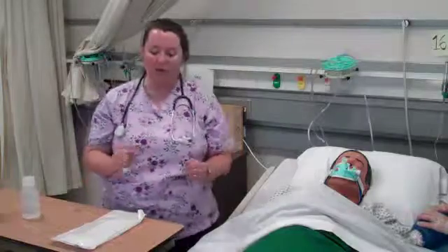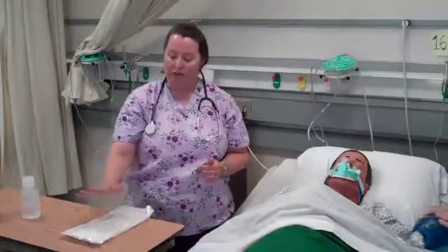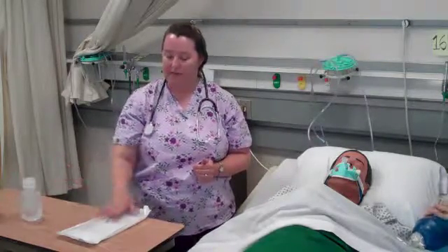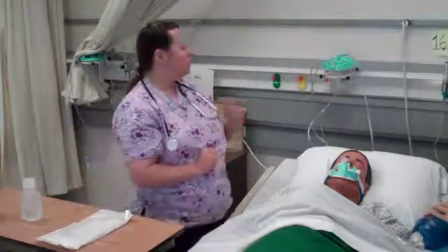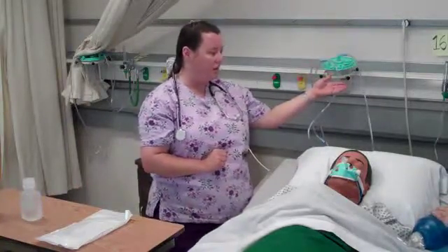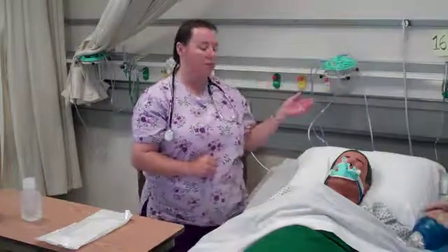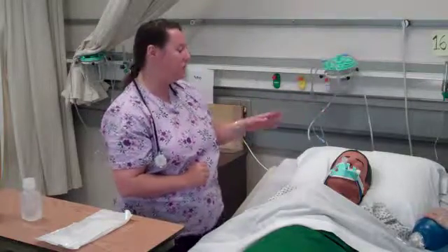I'm going to go ahead and make sure I gather the equipment that I need. I need my suction catheter kit, and here comes a container for my saline. I have sterile saline available. It's a sterile procedure. I'll demonstrate sterile technique as I go through this. I also want to make sure I have an oxygen source available to me. Patient is on a ventilator right now. We do need to give supplemental oxygen when we ventilate our patient in between suctioning.